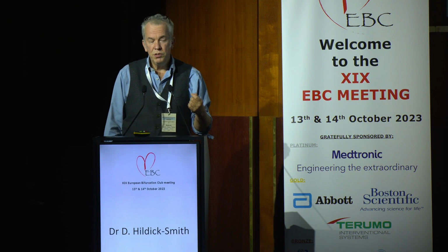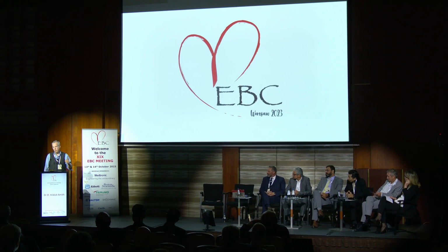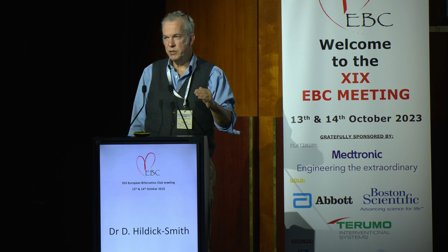And then I was influenced by Greg Stone's paper about the attrition rate that you can see when you look at prospectively followed stent groups over long periods of time. You can argue about what the percent rate is. Is it 0.5? Is it 0.7? Is it 1? But it's a percent rate. And there is attrition over time with the implantation of a stent.